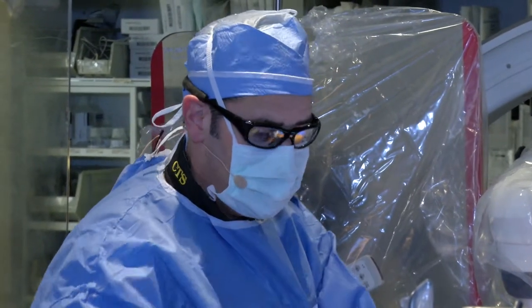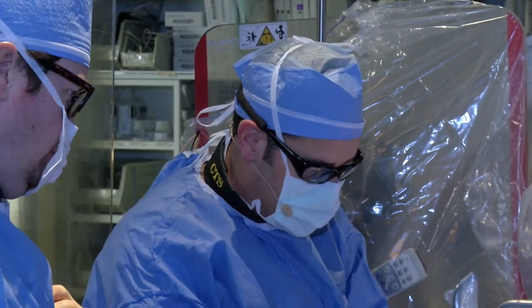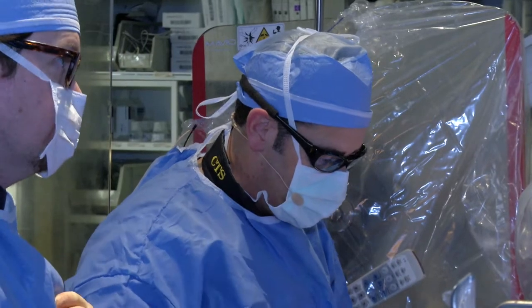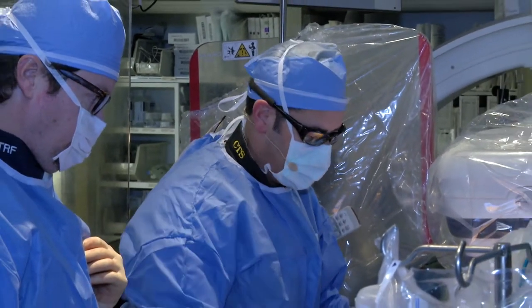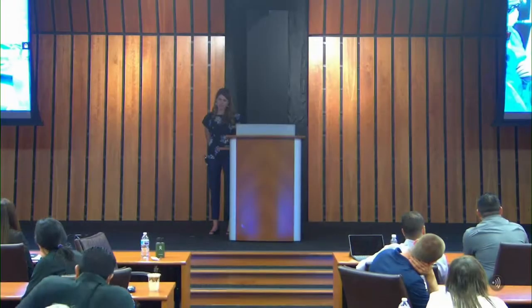There's some people that do one device first, and then at the end, they do a partial closure with that, and then try to put a second device in at 12 o'clock. There are various ways of doing it, and the answer is whatever works for you. If you get good success and no complications, I'm not going to argue about it. For us, this works well. I've done it for 12 years or so now, and it just works very well for us.